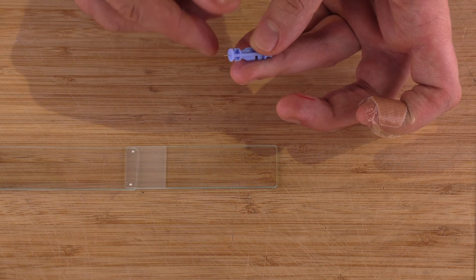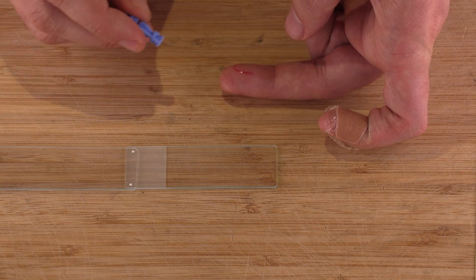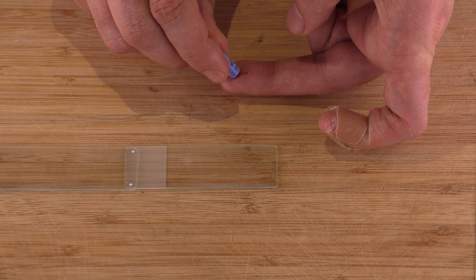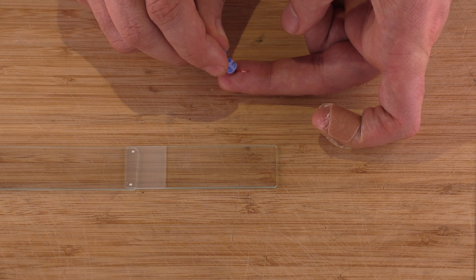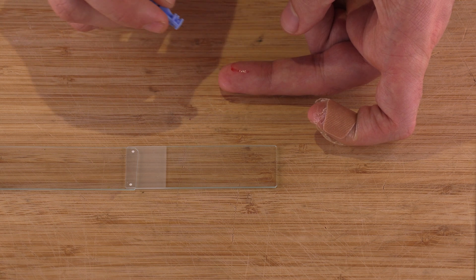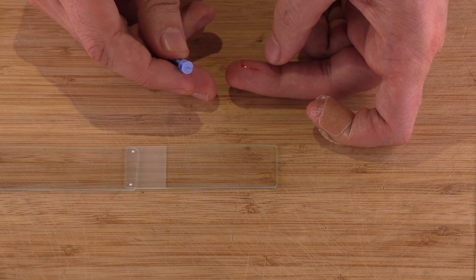It doesn't give a deep enough of a wound so it doesn't give me enough blood so I switched to this little blue lancet thing. This hurts a little more and you don't want to go too deep with it any deeper than you have to but I did a little bit of a prick.